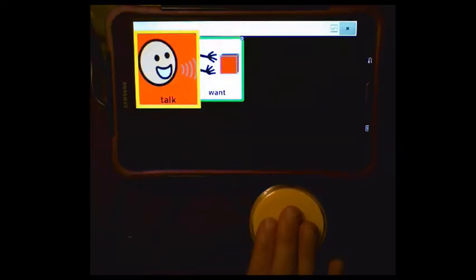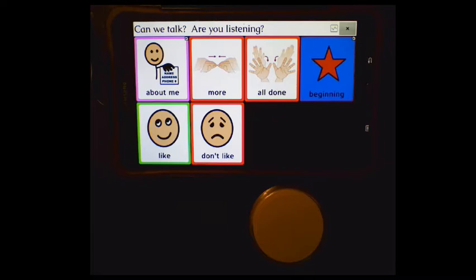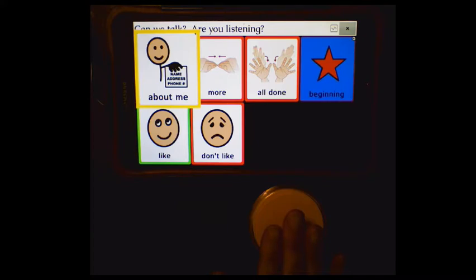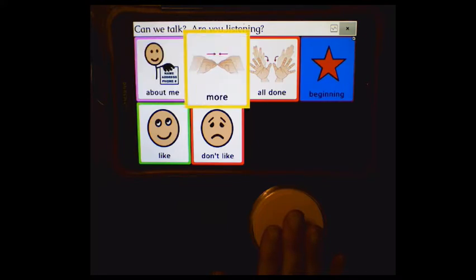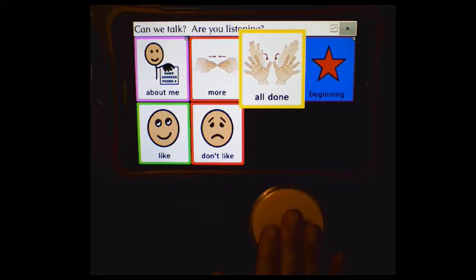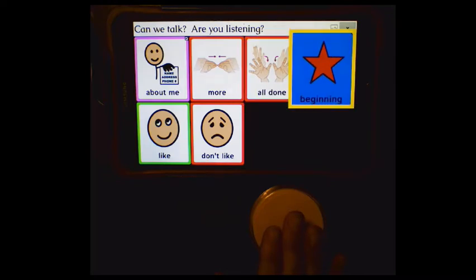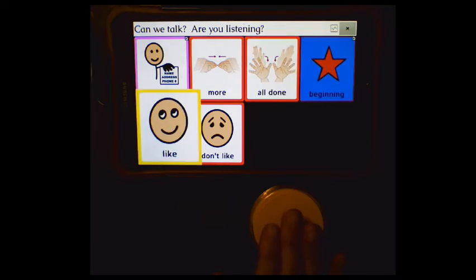In the Talk category, we see options like 'Can we talk? Are you listening?' with choices for About me, More, All done. There are also Like and Don't like buttons. Selecting Like says 'Yay, I like that.'